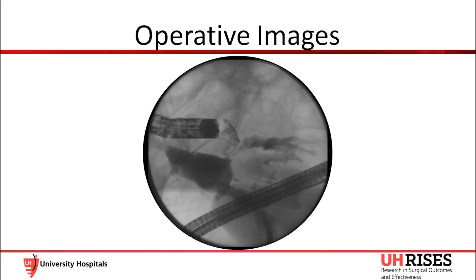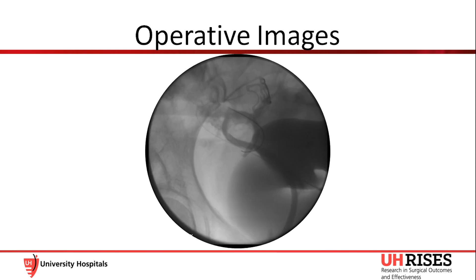Contrast was again injected through the drain, and this time there is no contrast seen in the colon. We then turned our attention to the colocutaneous fistula. The jagwire was advanced through the cutaneous portion of the fistula tract, monitored on fluoroscopy, and noted to enter the pericolonic abscess cavity. Using Seldinger technique, a 10 French Blake drain was advanced over the wire, through the colocutaneous tract, into the pericolonic abscess for additional drainage. This was secured to the skin with suture.